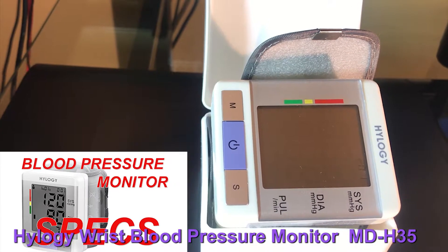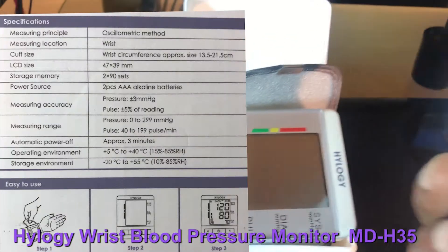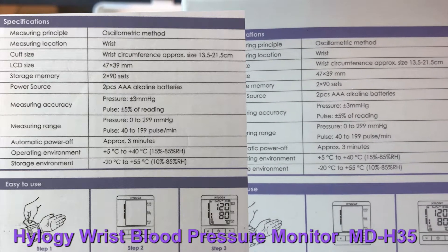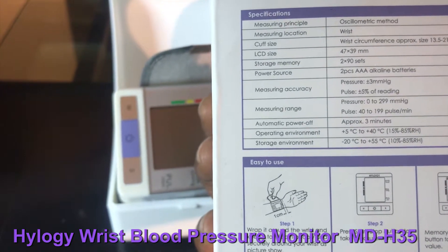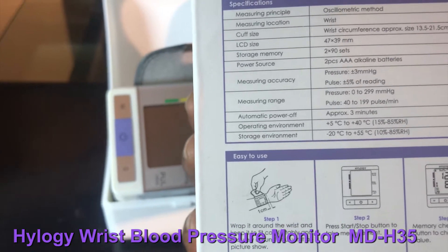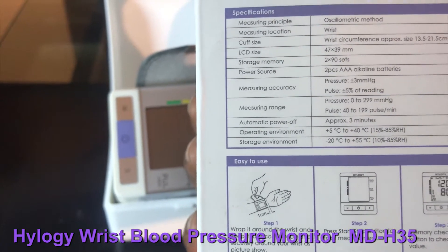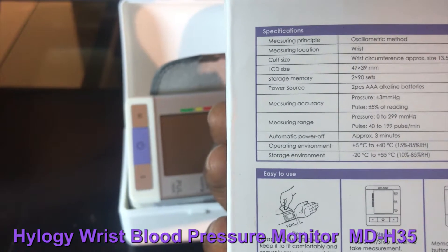Measuring accuracy: pressure is plus or minus 3 mmHg, and pulse is plus or minus 5% of the reading. Measuring range: pressure is 0 to 299 mmHg, and pulse is 40 to 199 pulses per minute — that's heartbeats per minute. It also auto shuts off.